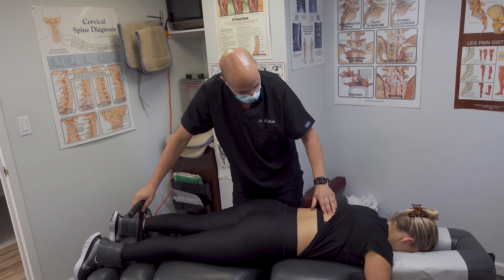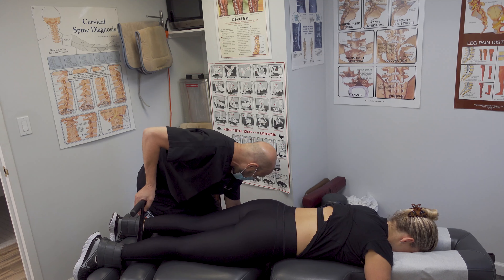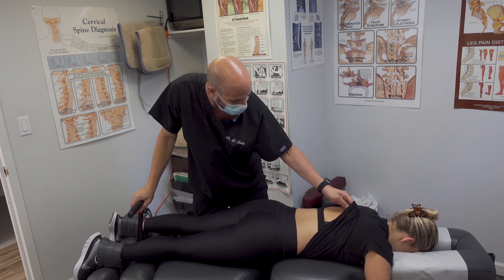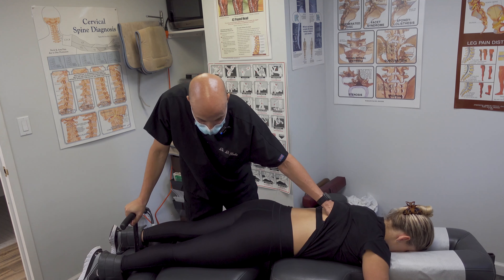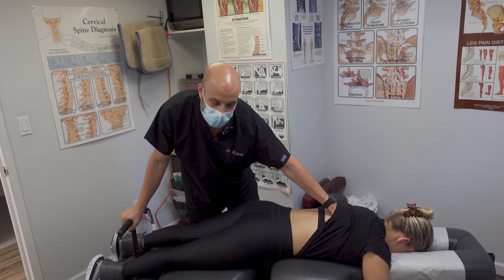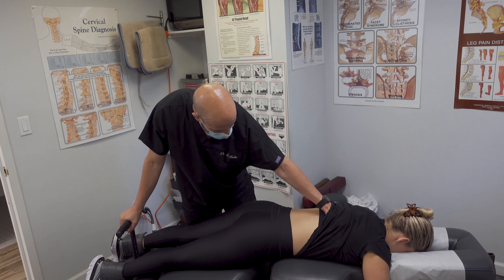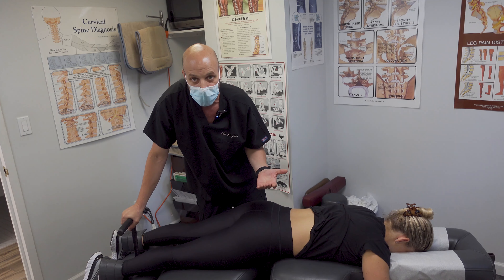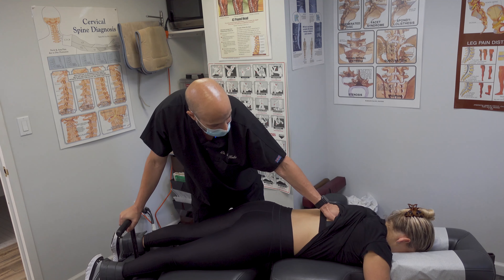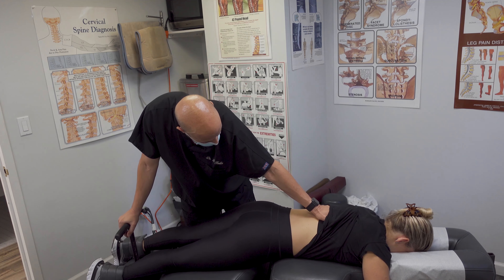I'm going to brace my hand higher up. She has a disc herniation and degenerative disc at L5-S1 — that's the bottom disc in the lower back — so we'll work our way down toward L5-S1, starting higher on purpose to tolerance test the patient. I see a lot of chiropractors not certified in this technique putting their hands in the wrong place. Just because a doc has the table doesn't mean he knows what he's doing. There are specific protocols. She's already passed protocol one — you should never strap the legs in without tolerance testing first. We've already done that.